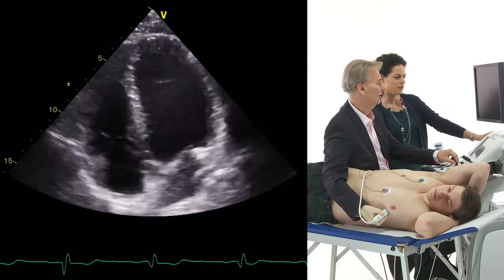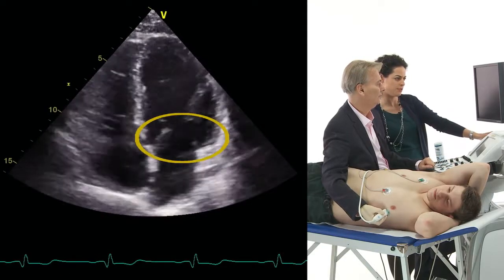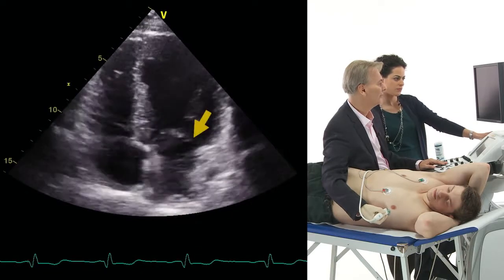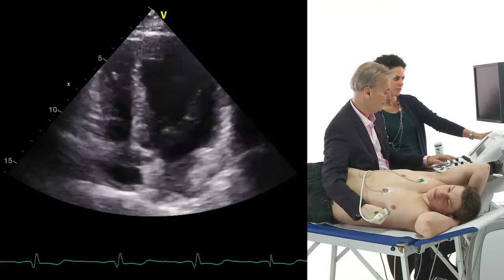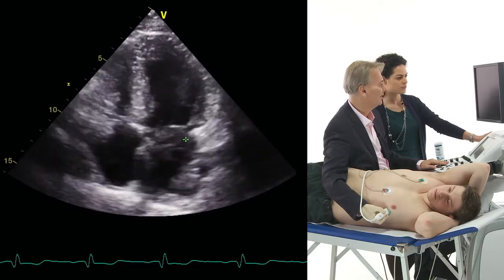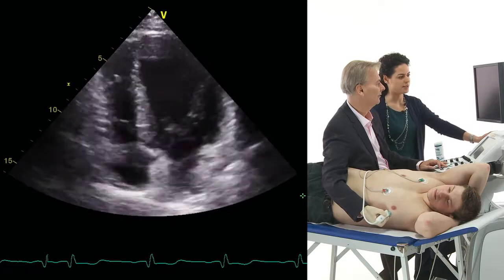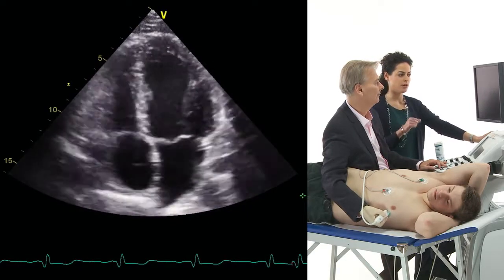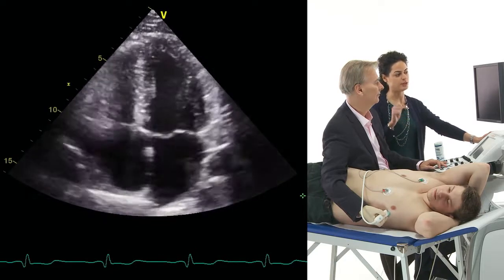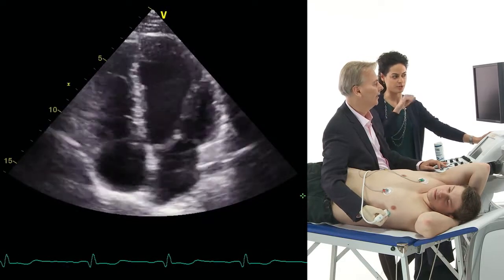This is really nice to see again, the mitral valve on the left. Yes, you see the anterior leaflet, which is a bit longer, and the posterior, which is a little bit shorter. Let me show you this. Here, this is the anterior leaflet. This is the posterior leaflet. Yes, actually, what I really like to do in my patient when I analyze the mitral valve is, again, after performing the parasternal long axis view with the tilting, I do it again here. So I focus on the anterior part. Yeah, I'll show you this.